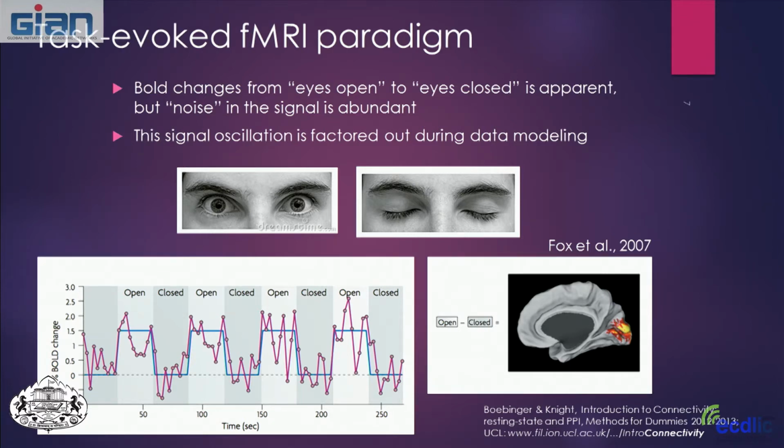But what they also noticed was that if they took this oscillation out, we still had this background noise activity. So you can see the higher frequency waves that are occurring up and down as the person goes back and forth through this task. So they asked the question, what actually is this activity? What is this thing that we have considered to this point to be noise?